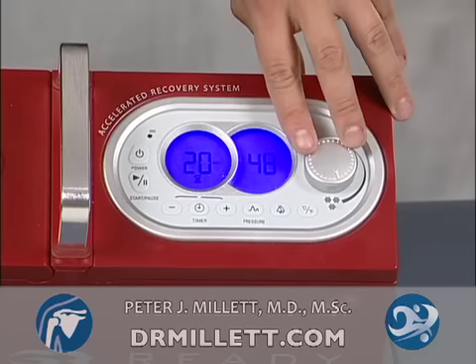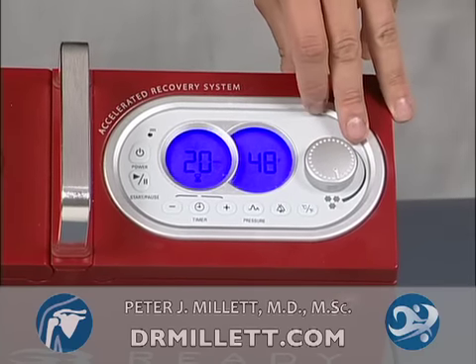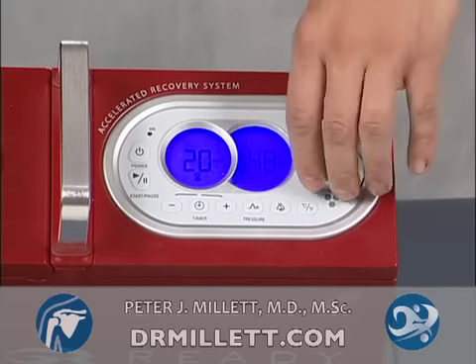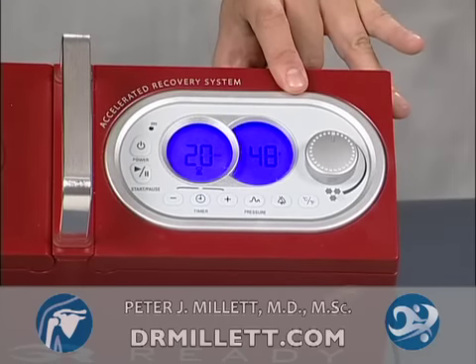This knob decreases the temperature of the unit. So 3 snowflakes means the coldest setting. Turning it to a single snowflake is minimal coldness.